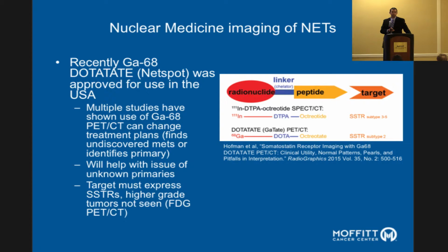So you'll take patients where maybe they thought they were going to be able to have surgery, but then when you do the gallium PET-CT, you say, oh my gosh, they've got so much tumor, so much metastatic disease that surgery would be of no benefit. There'd still be so much tumor left after the surgery that it's not worthwhile. So then you pursue medical therapy. Or if you're going to do a surgery, you do this and you find, oh my goodness, Dr.